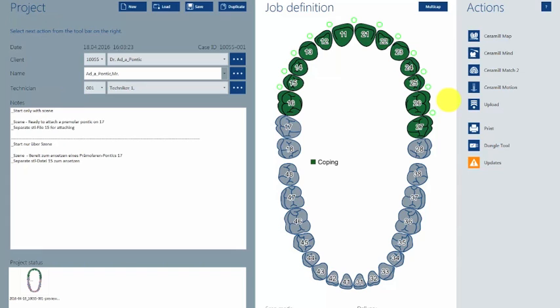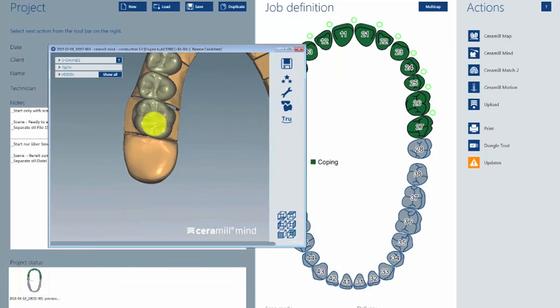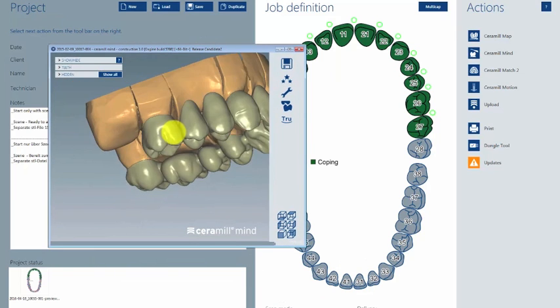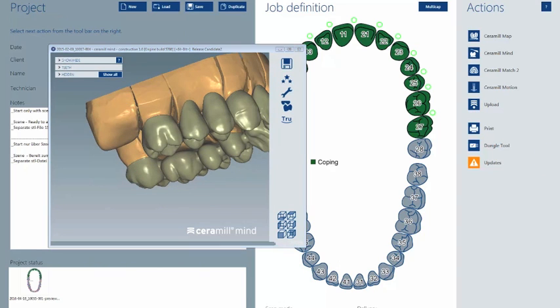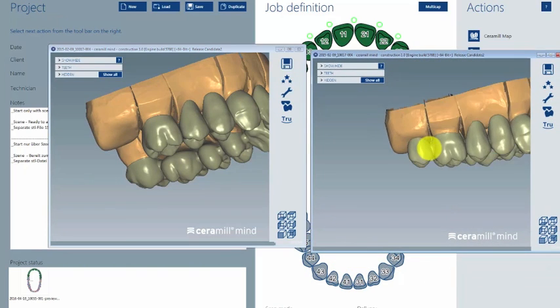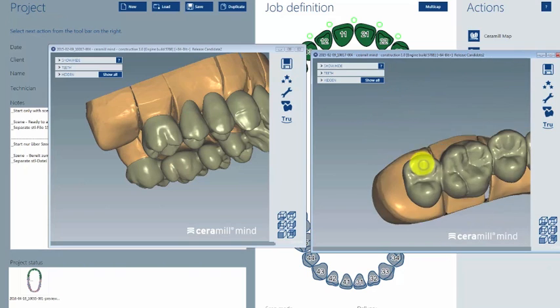Hello together! In this video clip I will show you how to add missing parts to a finished bridge construction. For example, if tooth number 17 is missing and you want to create another part at the 1.7 position, that's what I want to show you in the next few minutes.